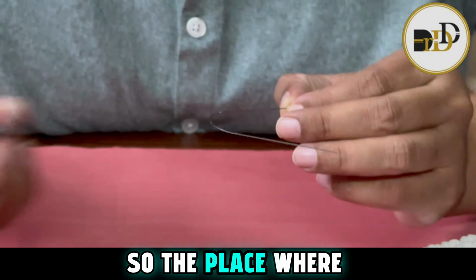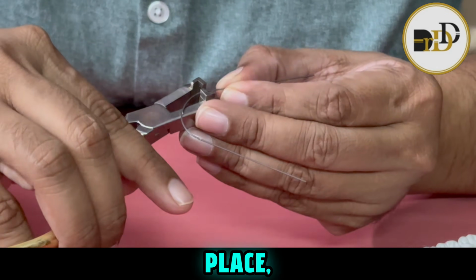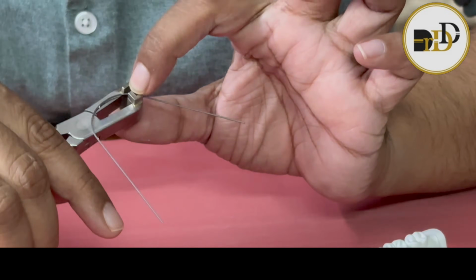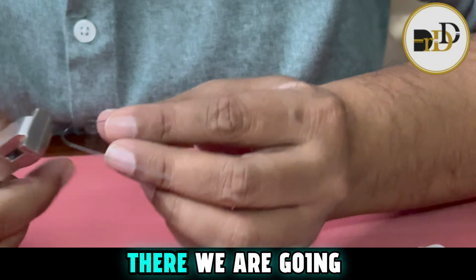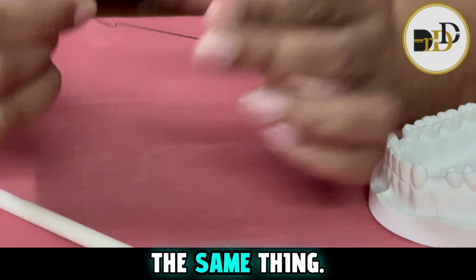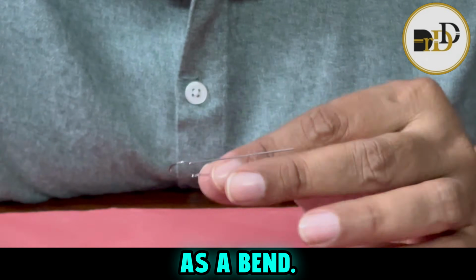To the place where I am marking, I engage the middle notch of the plier, and when we press exactly there, we get the bend. The same thing I am giving on the opposite side also.